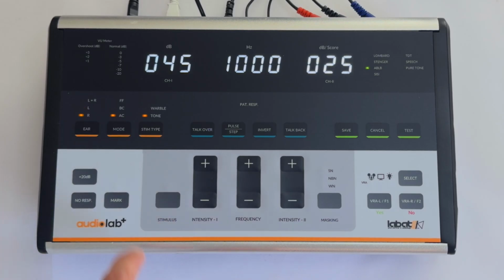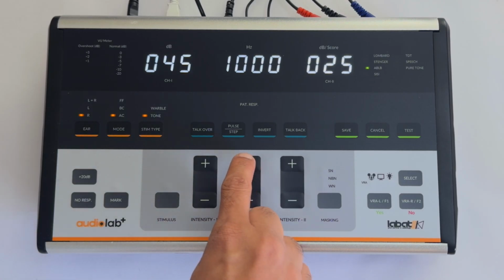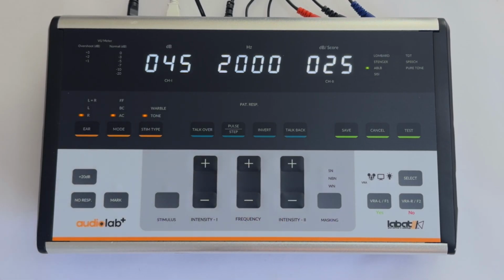Turn off the stimulus and click the mark key. Repeat the procedure at different frequency levels if required. To record the response, press Save and then Yes to store the test results. This concludes all the tests performed on the Audiolab plus Audiometer.